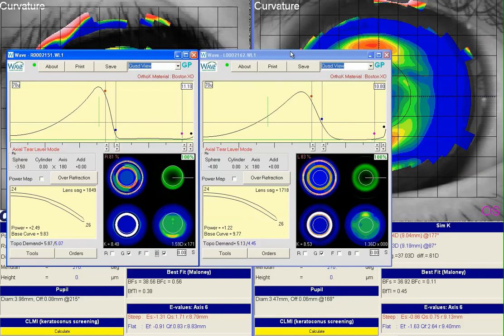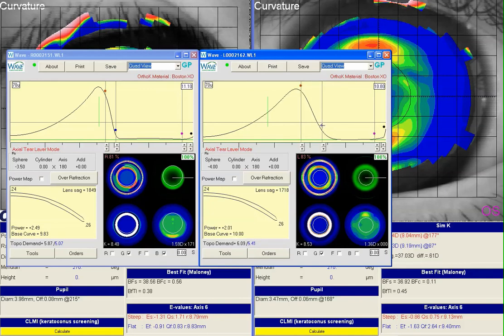In the left eye, there was a diopter and a half residual, so our new target will be 272. Again, I'm going to drop this down to 5.6 and 6.2. We're at 2, so we're going to have to go up a little bit. Overshot. Okay, we do have some funny kinks in the graph that we want to work out.